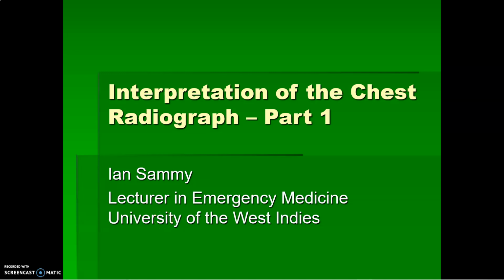Okay guys, so we have two short presentations on interpretation of the chest radiograph for you. The first one will take you through a systematic approach to the interpretation of the chest x-ray, and during the second video we will look at a series of cases and discuss the abnormalities on those x-rays.